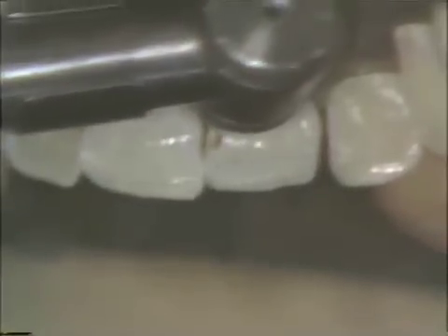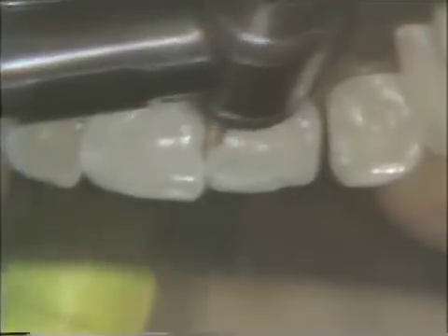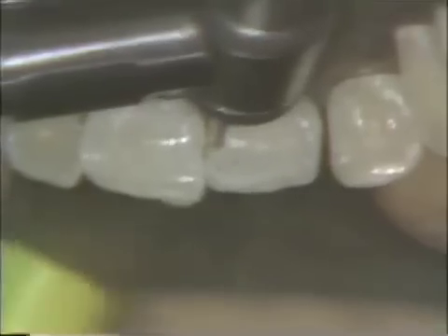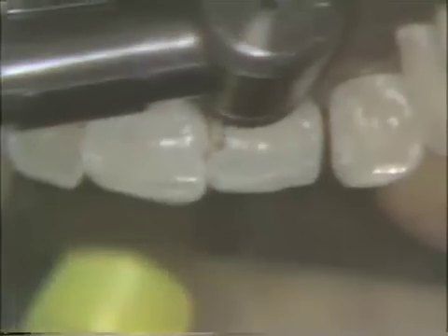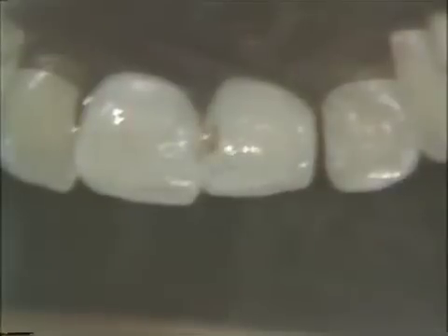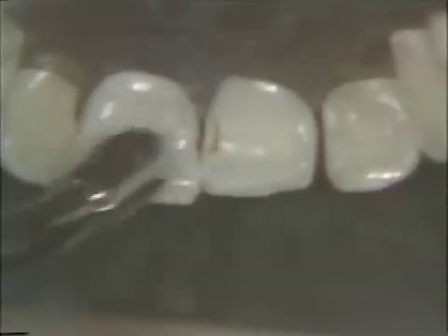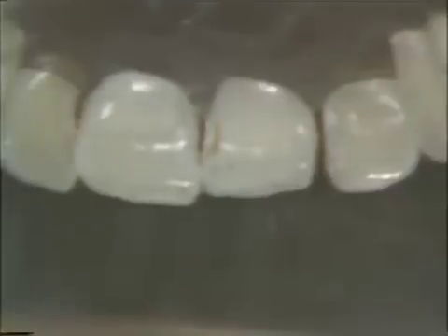If you look closely, you can see that there is stain, which is possibly carious lesion still on the axial wall, but we're paying no attention to it. We are going in now and forming what we would call an ideal cavity preparation. This in itself will give us a convenience form and access to remove the rest of the carious lesion.